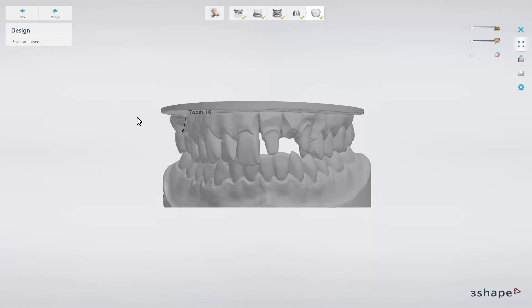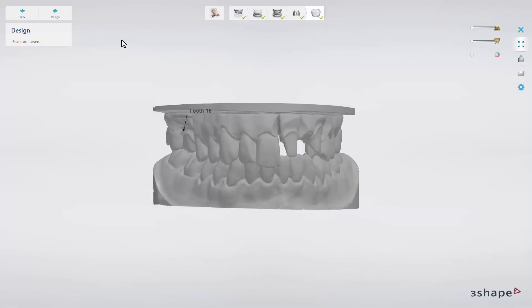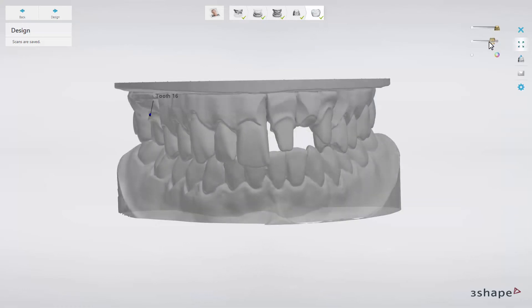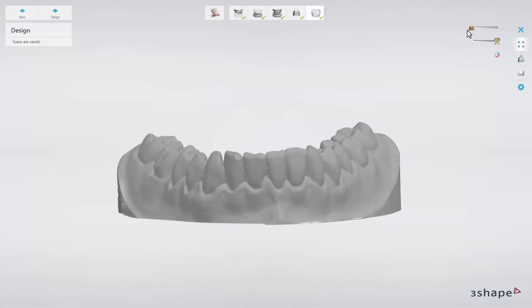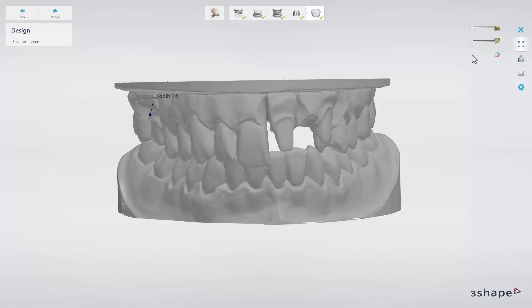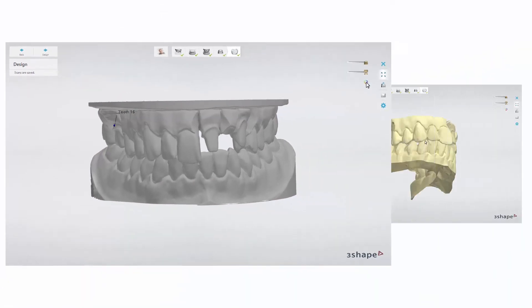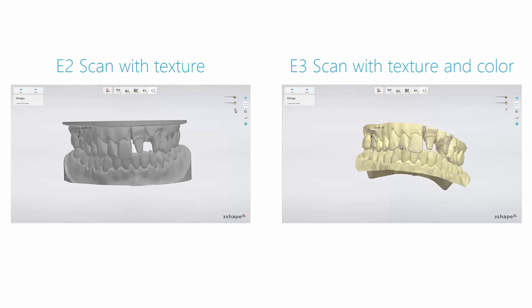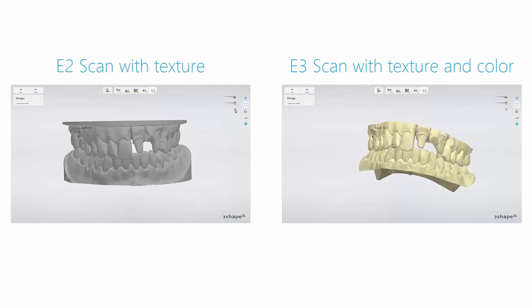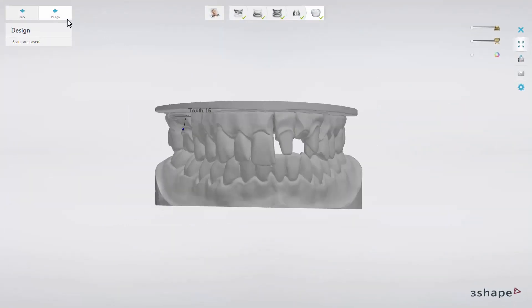In this step, you can check the scanning result. The sliders in the upper right corner enable you to switch off the lower and upper arch. Depending on the version of the eScanner you have, the scans may be monochromatic for the E1 and the E2. The E2 scanner will also have texture added to the scan, like in our case. E3 scanners will have colour scans with texture. Once the scanning is finished, you can go straight to the dental designer by clicking the design button.